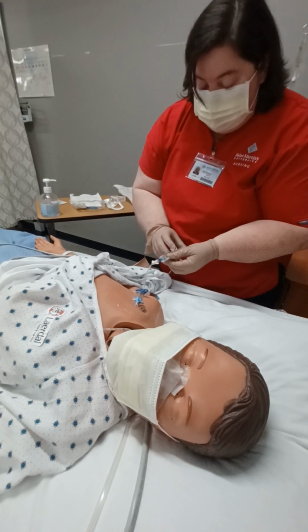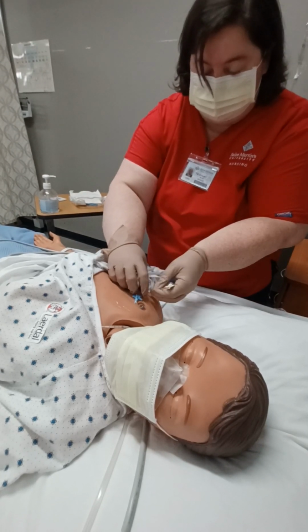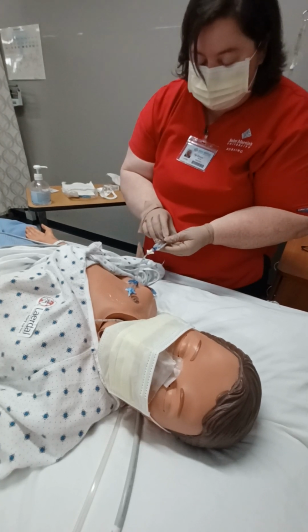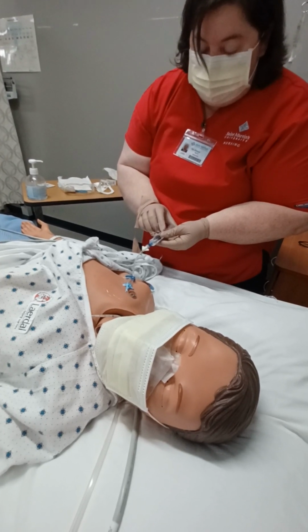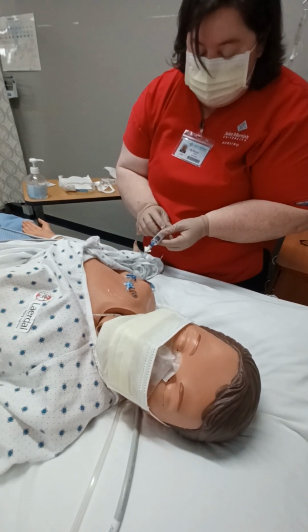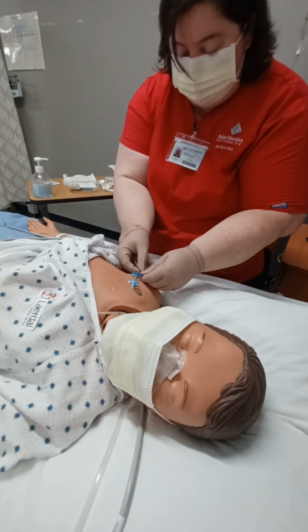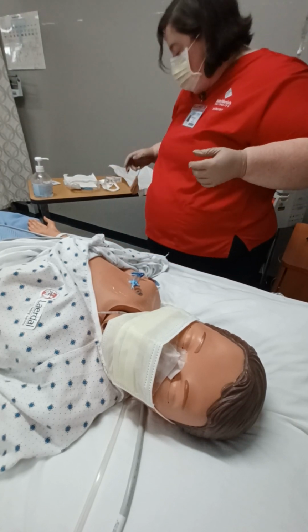Instill 3 mLs initially. Again, unclamp it first. And pull back and check for a blood flash, which we got. And then we would do the same procedure. Short bursts of 1 ml over 1 minute until we have reached 0. Doing this just checks for patency of both lines to make sure that there's no clogs. Perfect. Reclamp. And again, if I had an antimicrobial, I would put that on there right there.